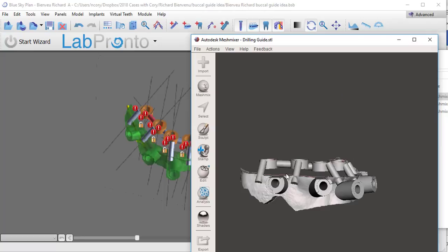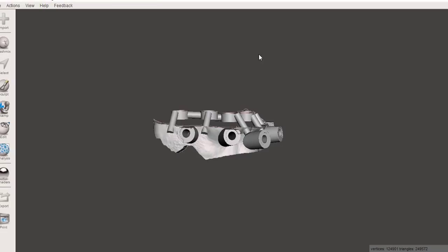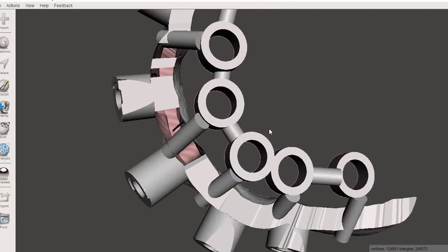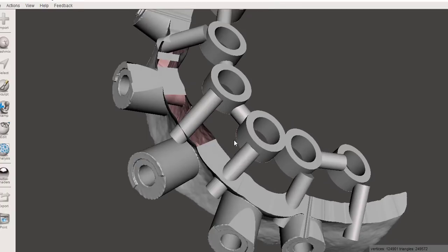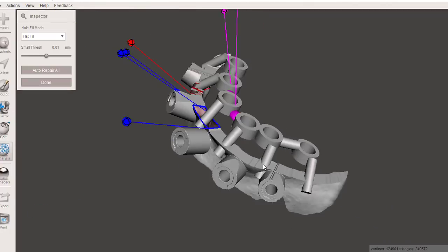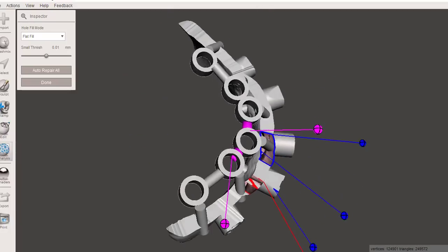Okay, and as you see right here, when we open this up, this now is a single STL. Now remember the mesh cut failures from earlier? Those need to be repaired. And so all we have to do to repair that is in Mesh Mixer, you can hit Analysis, Inspector. It's going to highlight for you what it sees as mesh errors.